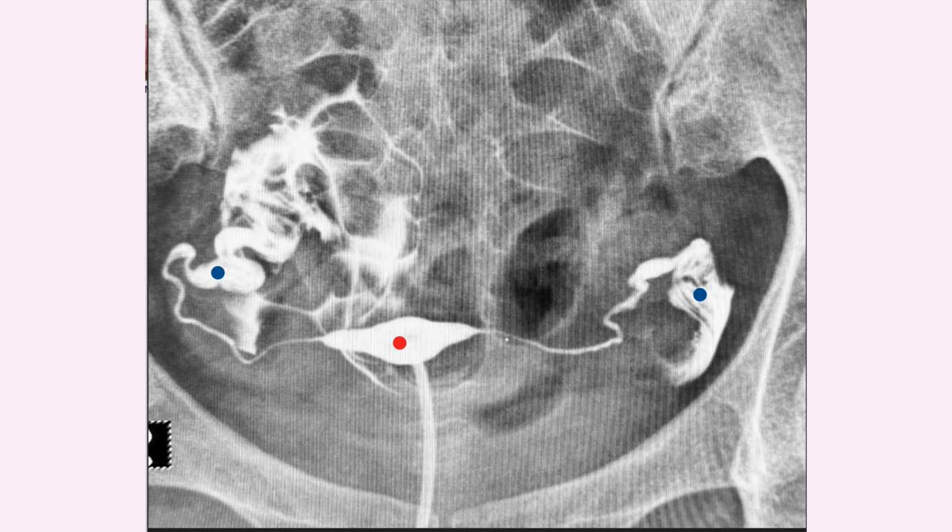However, one must remember that in 10 to 15% of cases in which a hysterosalpingogram has been done, there is a chance of a false negative report. And this is because of the presence of tubal spasm in the tube. So if a patient has a negative report, then it means that the patient has to be evaluated further to identify, firstly, whether the tube is indeed blocked, and secondly, to identify the reason for the blockage of the tubes and to see if there is any other damage in the pelvic cavity.